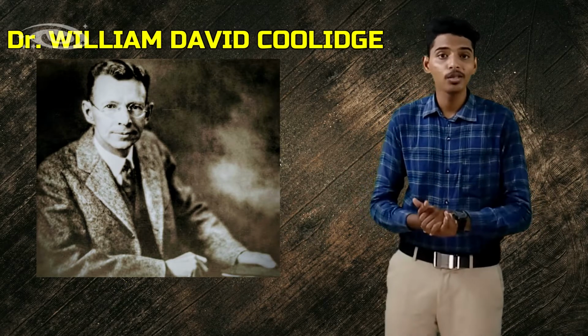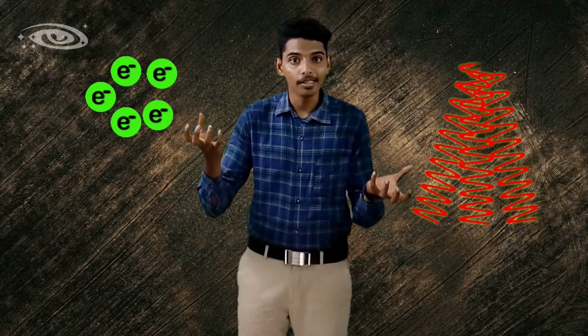Coolidge X-ray tube was first invented by an American physicist and engineer called William David Coolidge in 1913. This Coolidge tube made a great revolution in the medical field because in this tube we can control the electron emission and the X-ray emission separately. Because of this reason, these X-ray tubes made a great revolution.